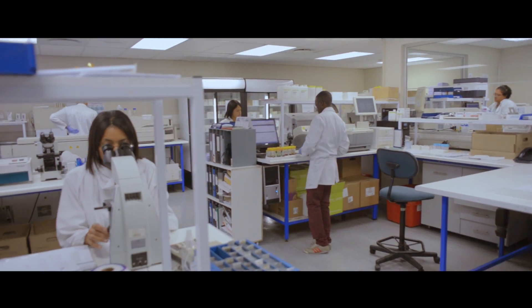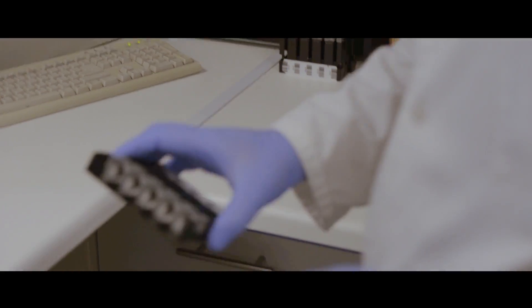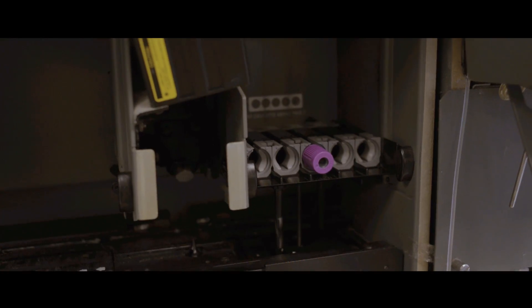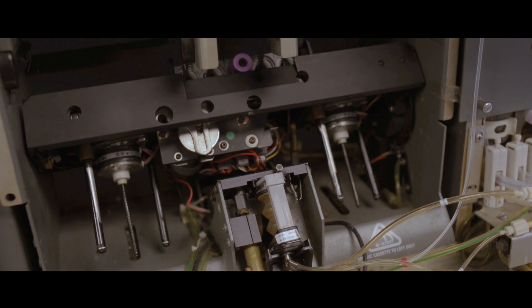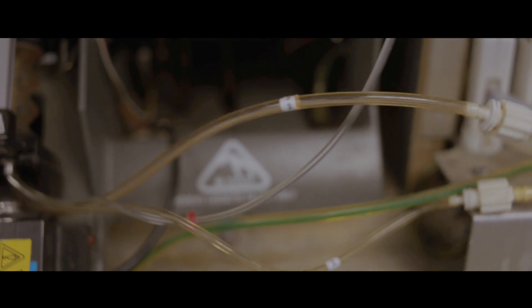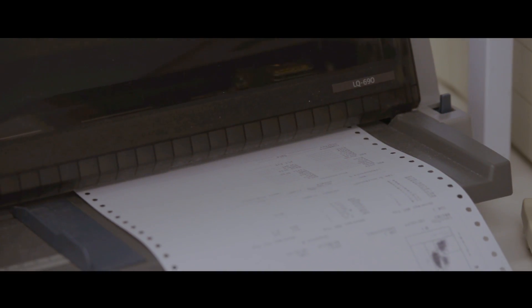With the purple top specimen, we actually want to count the amount of cells in your blood. We put it through the instrument, which is what we call a cap-piercing system. It will go straight through the rubber and send a probe into the blood sample to take a certain amount at once, and it will run it through the instrument and physically count all the different cell lines that you have.